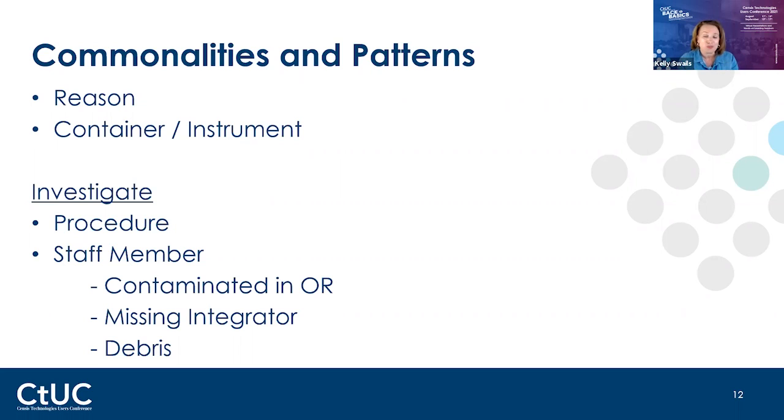So then that's where you rely on whoever's in assembly, that when they're doing that inspection, that they're looking. So really, if there's a dirty instrument, that really falls more on your assembly person, but there is some portion of that needs to be owned by decontam. So education there to say, hey, I know you know this set like the back of your hand, but I think you're going too fast. You're probably not inspecting. We need you to inspect and look and see.